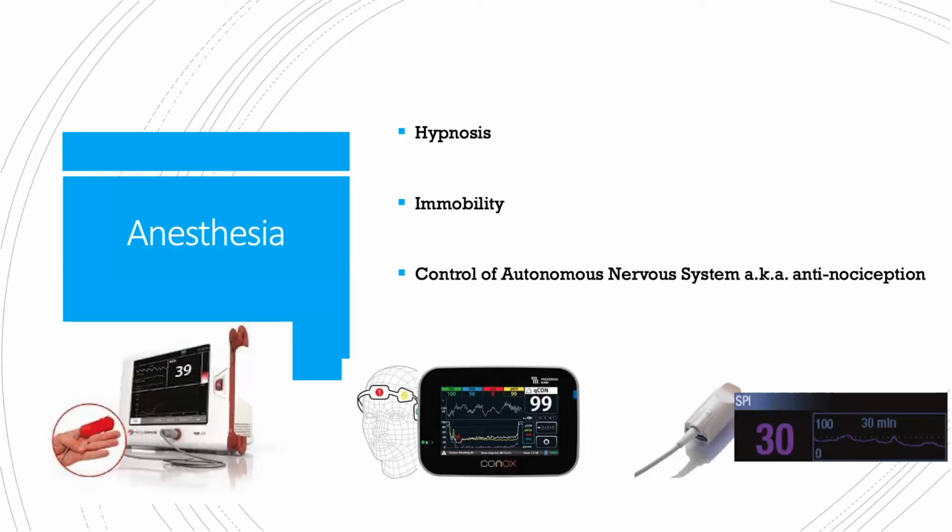In our study, we tested 3 devices. The first one is the nociception level index, or NOL, from Medasense. The second one is the qNOX from Quantium Medical. And the third one is the surgical pleth index, or SPI, from GE.